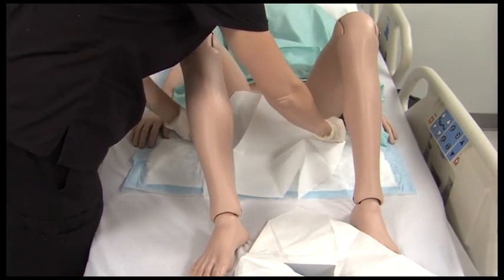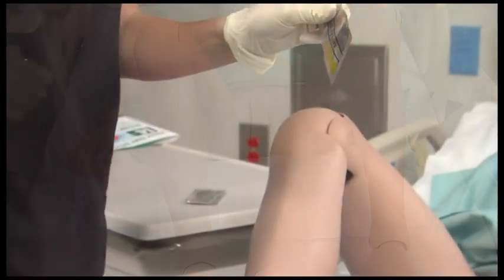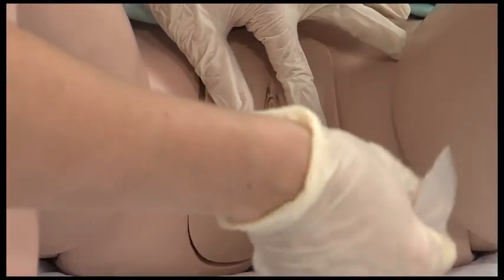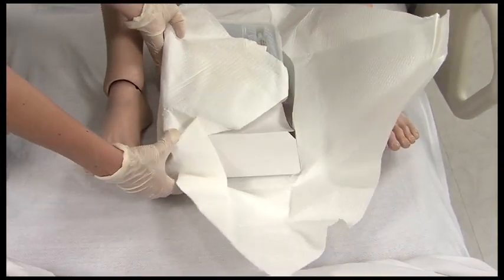Remove the under pad found beneath the third fold of the wrap and place it underneath the patient, plastic or shiny side down. Open the packet of Castile soap wipes. Remove and unfold all 3 wipes to cleanse periurethral area. Use each wipe once in a top to bottom motion. Advance the tray and wrap toward the patient.